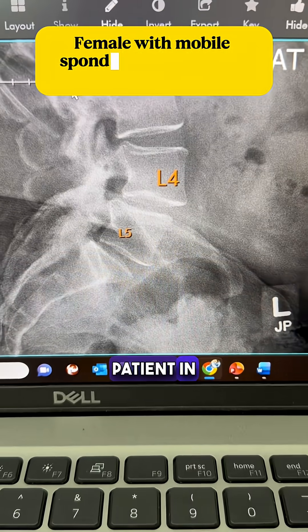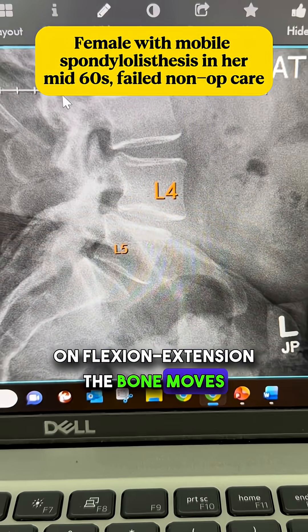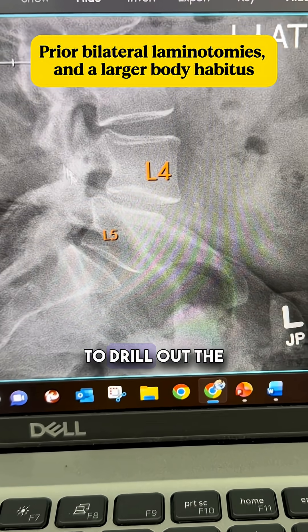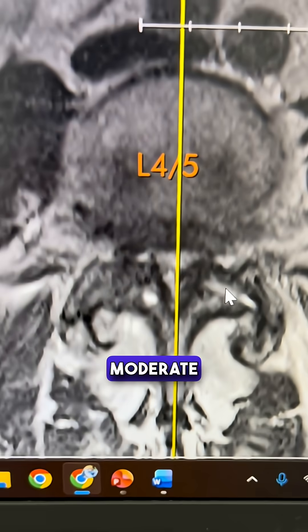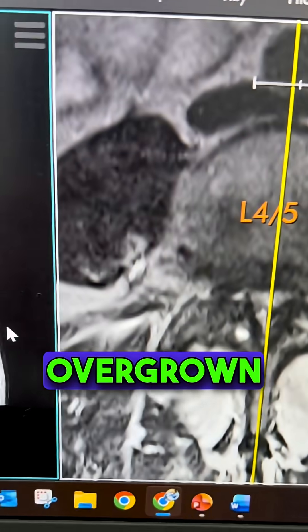This is a patient in her mid-60s. She has spondylolisthesis at L4-5 on flexion-extension — the bone moves. She had prior bilateral foraminotomies, meaning they went in from the back and did laminotomies where they tried to drill out the nerve tunnels. Her MRI shows the slippage as well as compression, moderate stenosis squeezing the nerves, and giant overgrown facets.